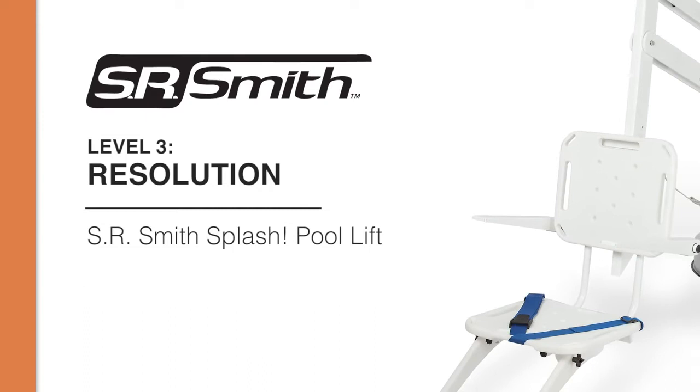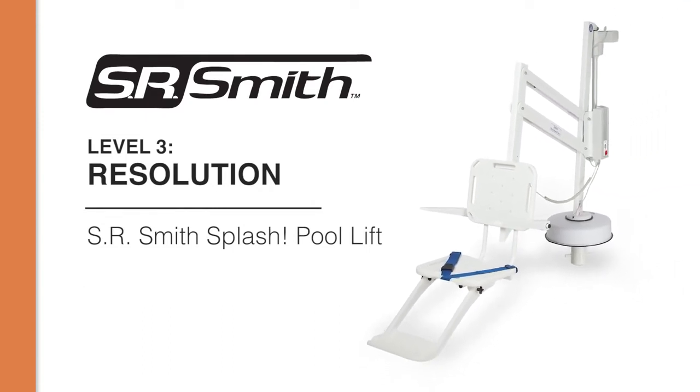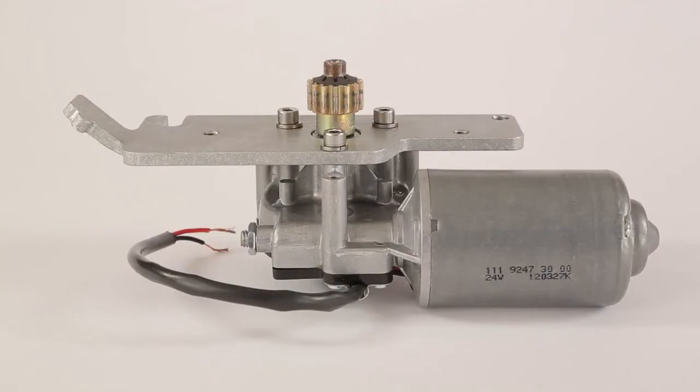In this video, we will show you how to remove and replace key components in your lift. These components include the control box, the actuator, actuator cable, motor assembly, and the gears.